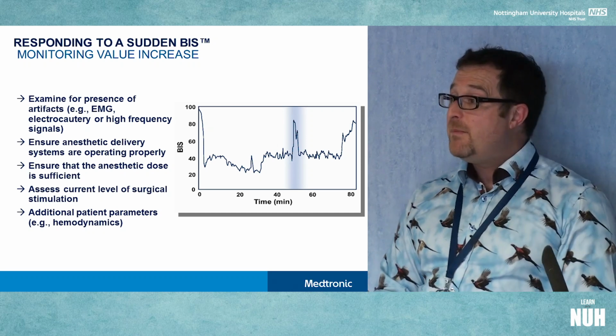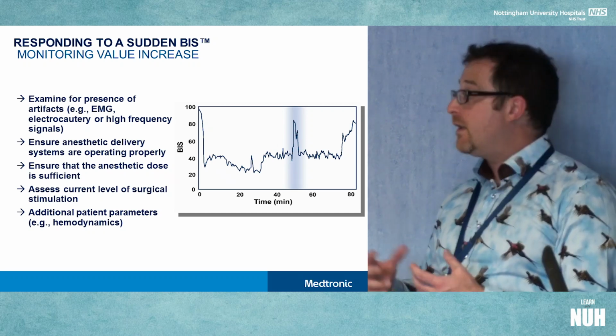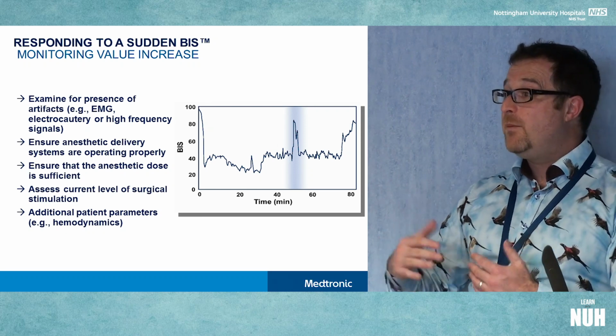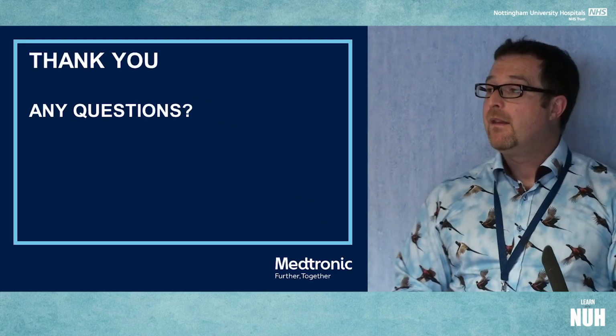And then rises in BIS, conversely, we could have EMG or artifact, a lot of electrical noise. Again, we're looking at any changes that we've made pharmacologically and assessing whether the surgical stimulation has changed. Okay, that's it.